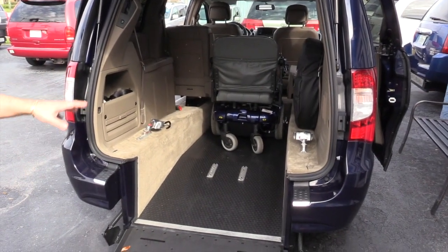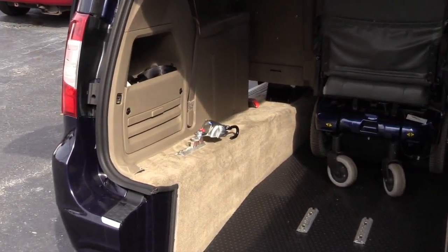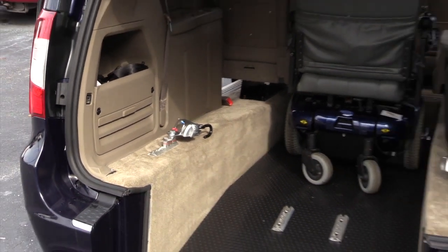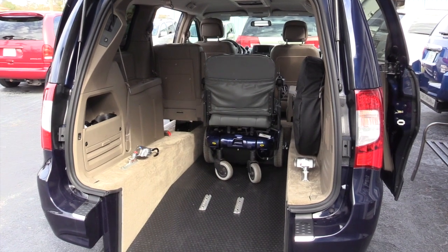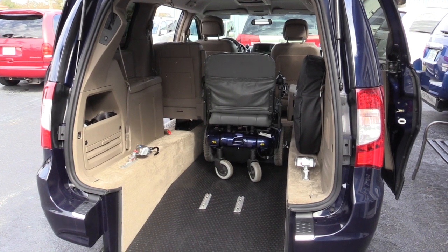The automatic retracting tie downs have a storage space up and out of the wheelchair containment area so they don't get in the way when you're moving the wheelchair in and out of the van. Once your wheelchair is in the vehicle, you can relocate the retracting tie downs to the appropriate place to lock the wheelchair down like this.